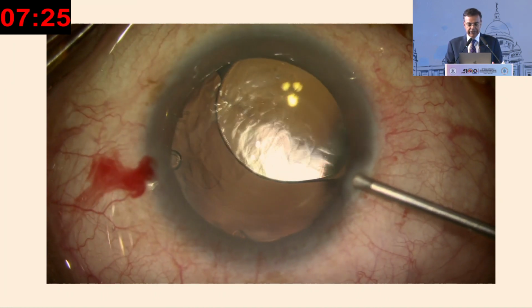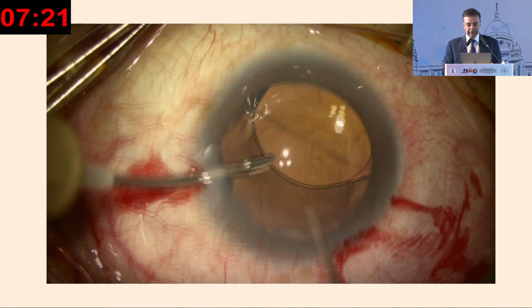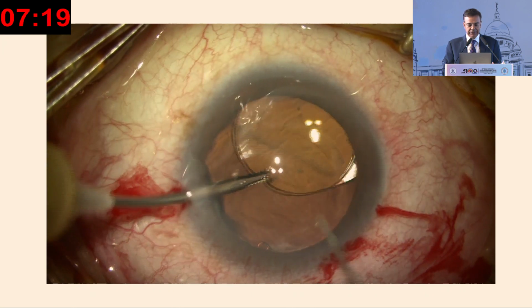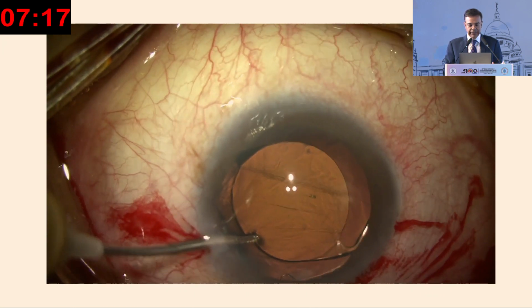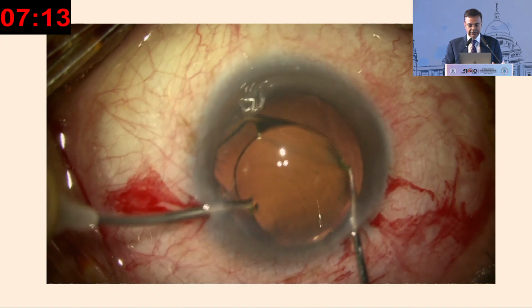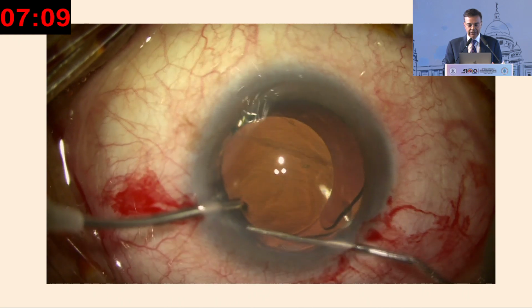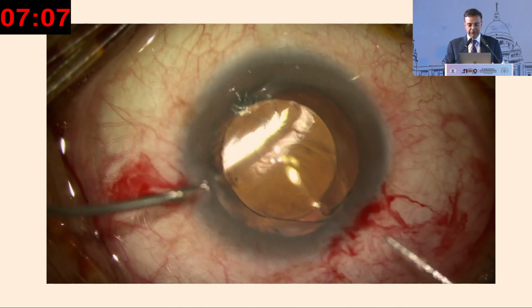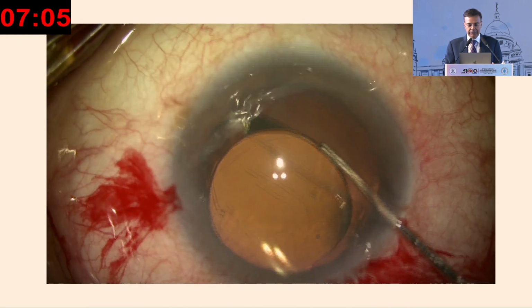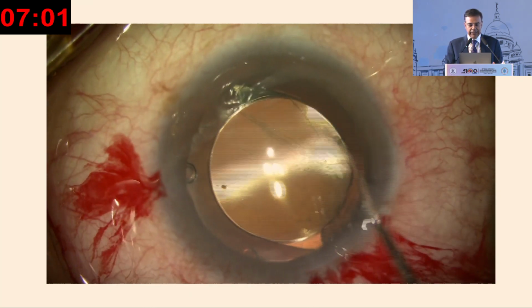But when I went in I saw that there was no vitreous. So we just had to hold it with forceps. Here you don't need to use the dialer or the other instrument as I showed in the previous case. You can use these MST forceps, and I just negotiated the lens forward. I didn't bring the haptics forward, again an anterior optic capture, because now the capsular rhexis is fibrous, so it's easy to capture a single piece lens.